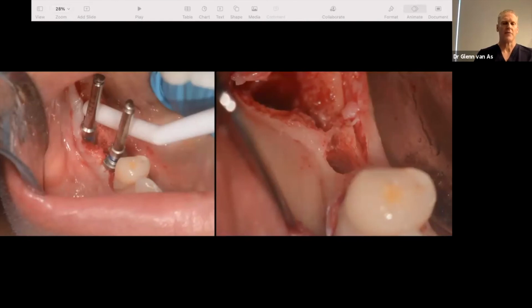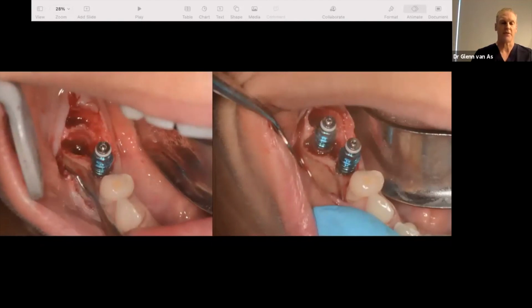Now, a lot of times versa-burrs are around, and they can be utilized in a counterclockwise rotation to expand your bone, and you're left with a situation where you got the implant in, but there's very narrow remaining buccal plate. So in this case, we'll actually graft, do some GBR on the site, but we would like to get some bleeding to encourage the release of PDGF. So we got our 2 implants in, but it's very narrow in this area right here. Very, very narrow and very thin.